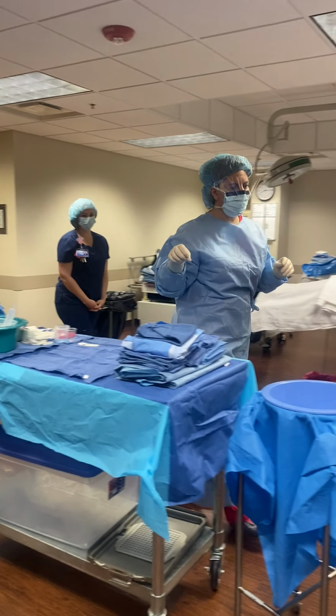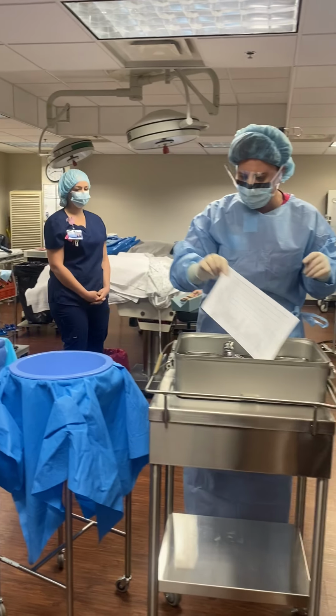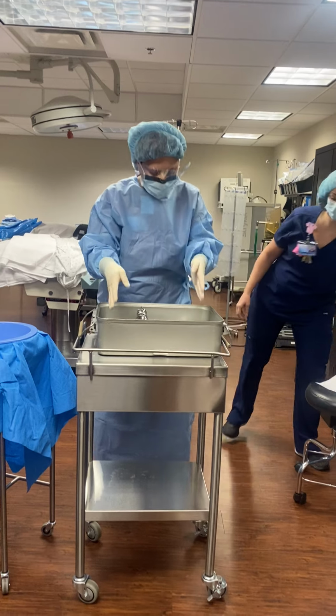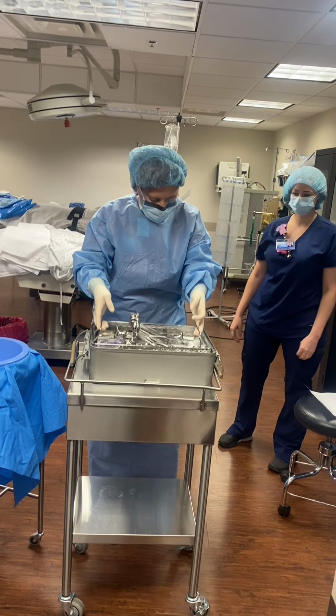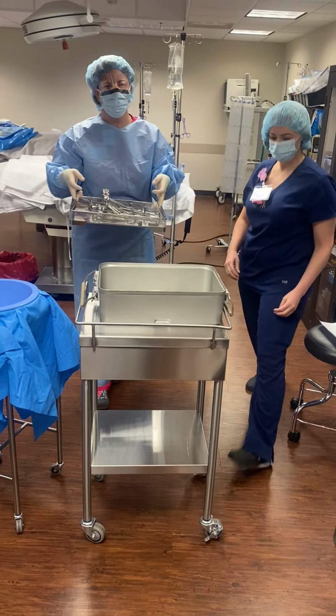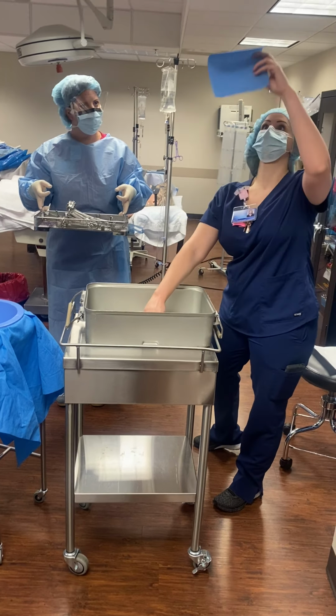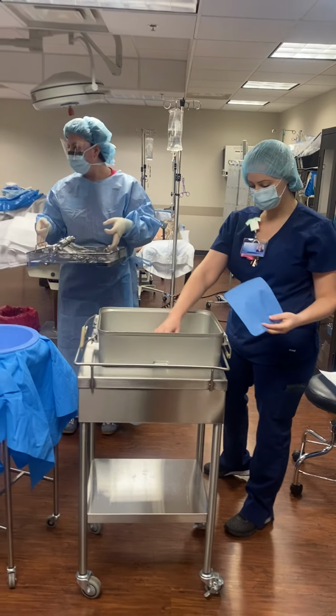Okay, I'm going to get my instruments. Here's a gift. Thank you. Can't say you never gave me. I know, right? I see the indicator, and it is good. Good.